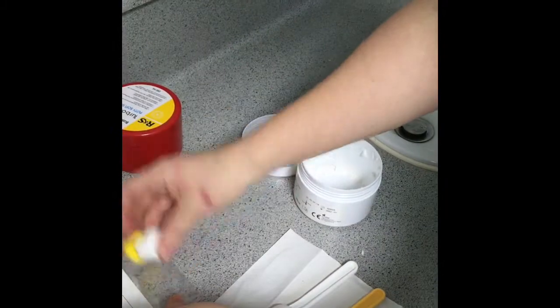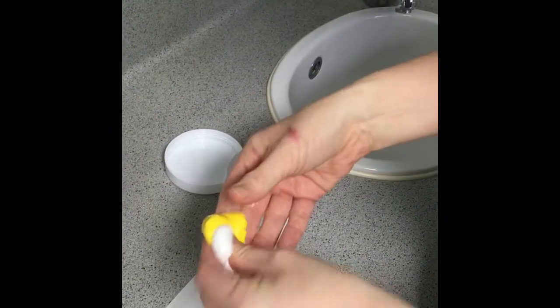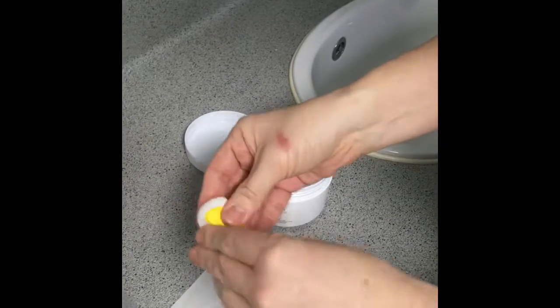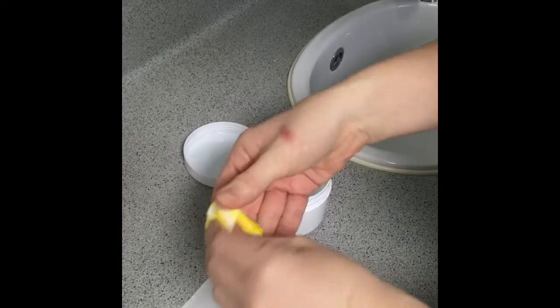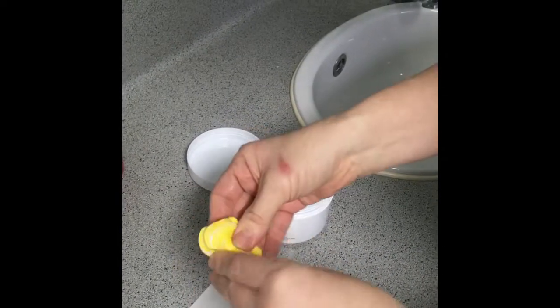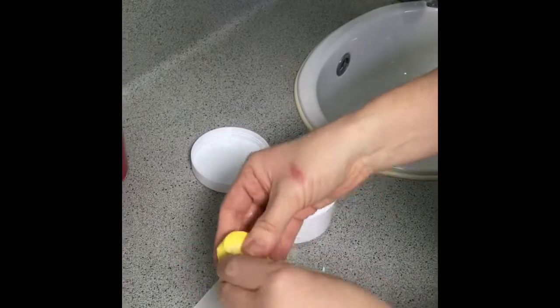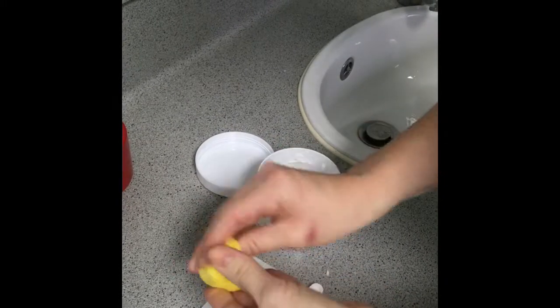Hold the two portions together and mix using the tips of your fingers, just pushing it together until it forms into one colour. That takes about 30 seconds — it should be one uniform colour.